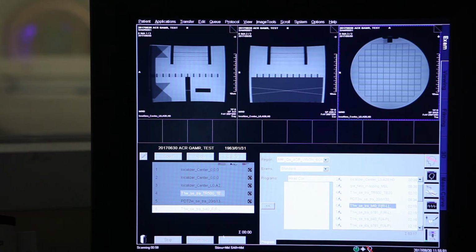How will we image the homogeneity problems of the magnet with the 2 bandwidth images? How do we image? What do you mean?